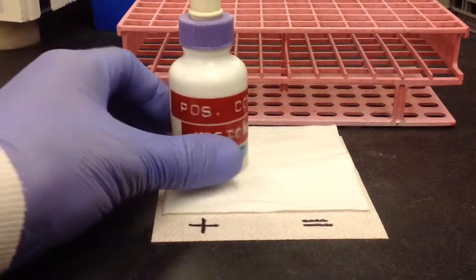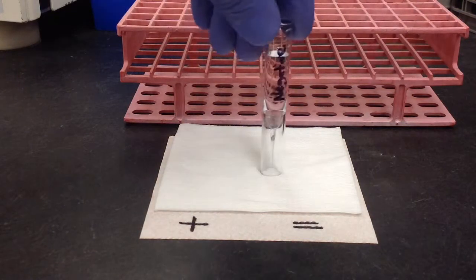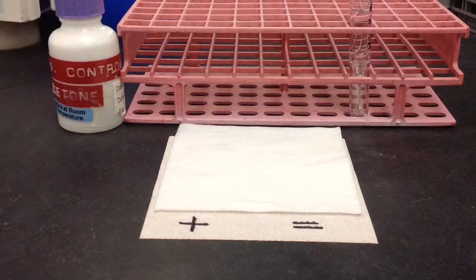For my specimens, I'm going to be using a positive control and a negative control. In this case, my negative will be deionized water.